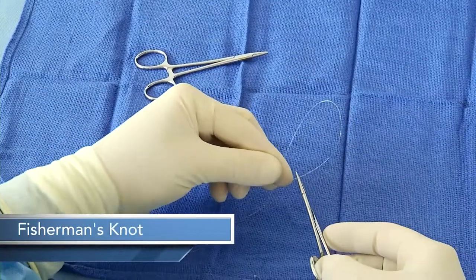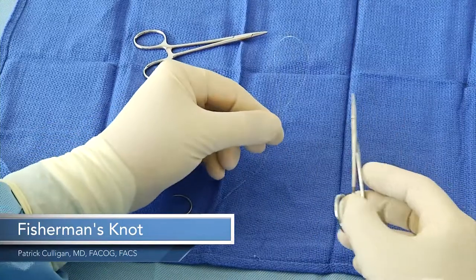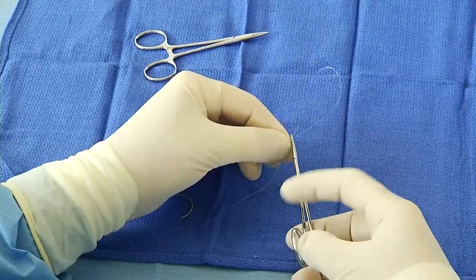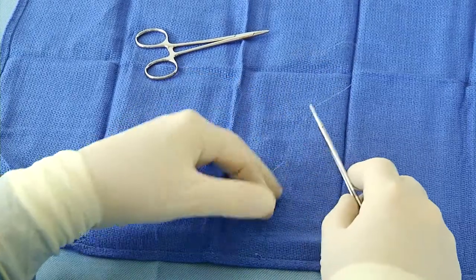I'm going to demonstrate a fisherman's knot so that you can have a loop at the end when you're going to close the peritoneum. The first step is to create a loop. I usually put a mosquito clamp on there just to hold it.